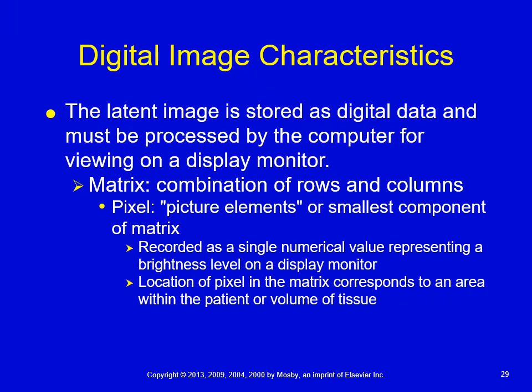Knowing what pixels are and what they do for us is really important. These are definitions that you need to know: matrix, pixel, latent image, manifest image, and also know how pixels can affect your image quality.